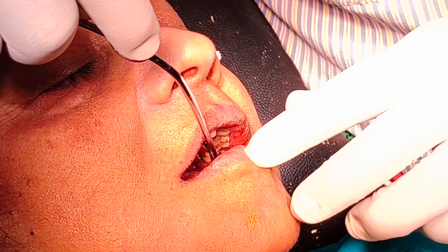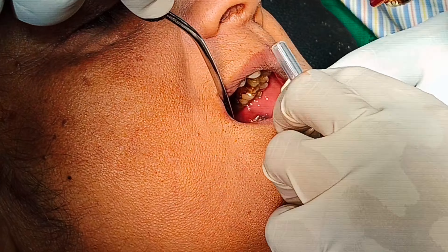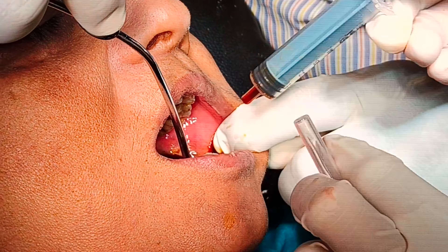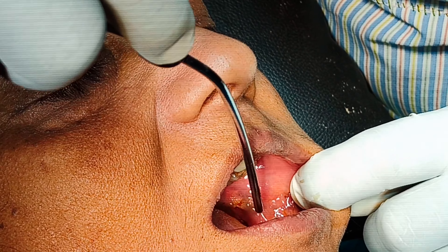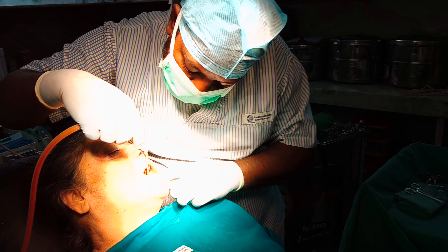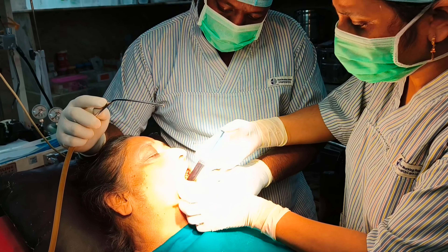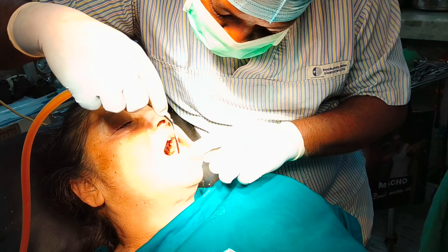I have to cover the face — it's so easy. I'm not sure what the face is like. Do you want to cover the face? I have to cover it. This is the suction machine.